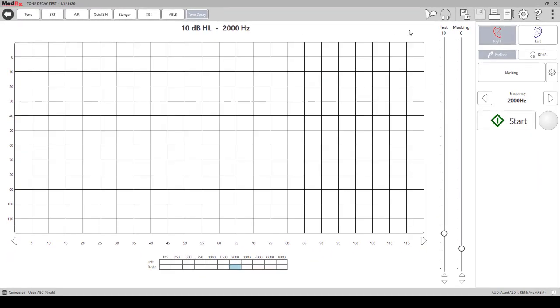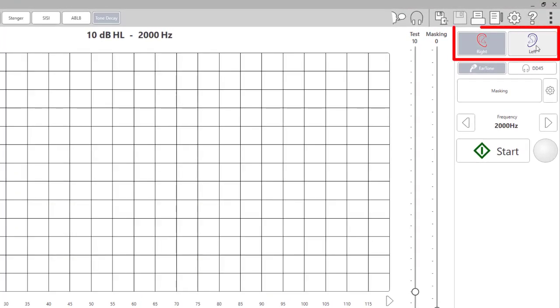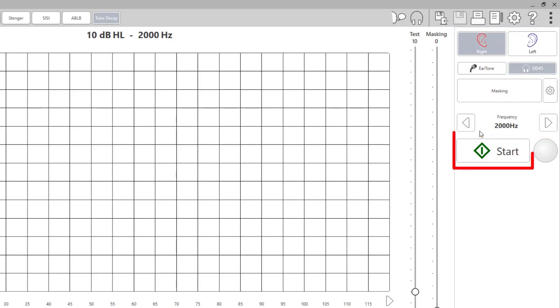From here, you can select which ear you would like to present to, your transducer, the frequency at which you would like to present the first tone, and then the start button.